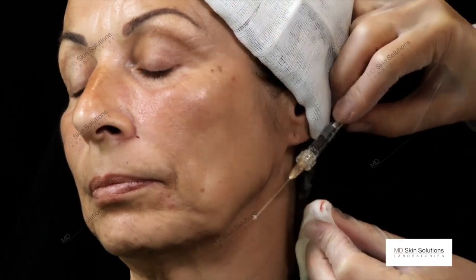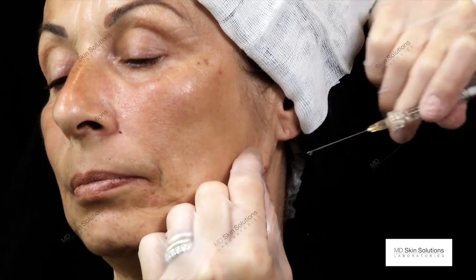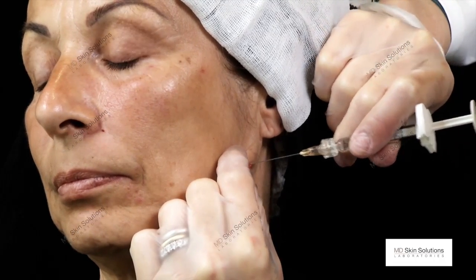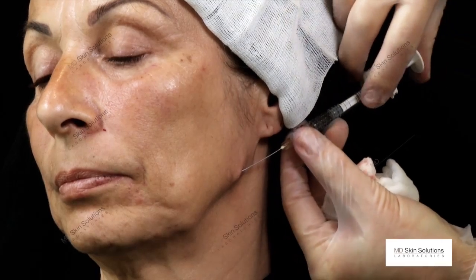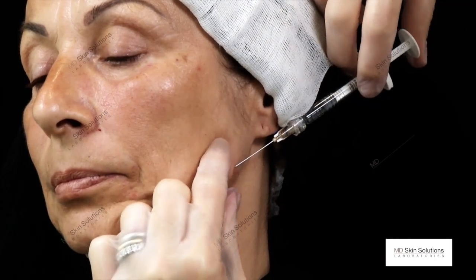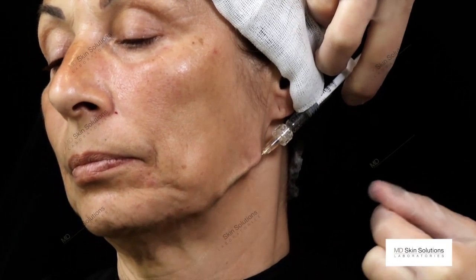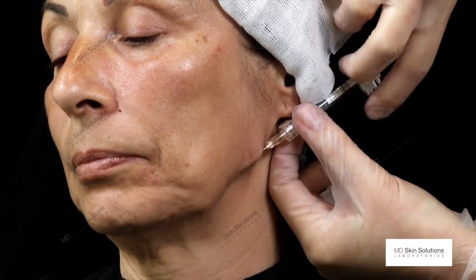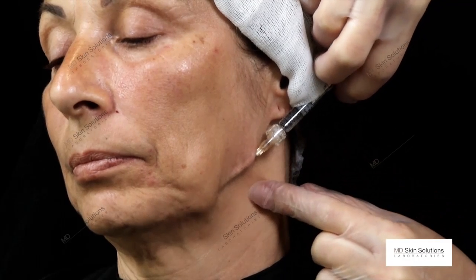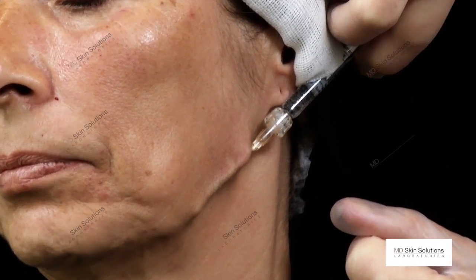In her case, the 1.5 inch is totally enough in terms of length. Again, I pinch the skin, insert the tip, and now I navigate in the subdermal level with my index finger and the thumb in order to place the cannula in the right level, in the subdermal level.